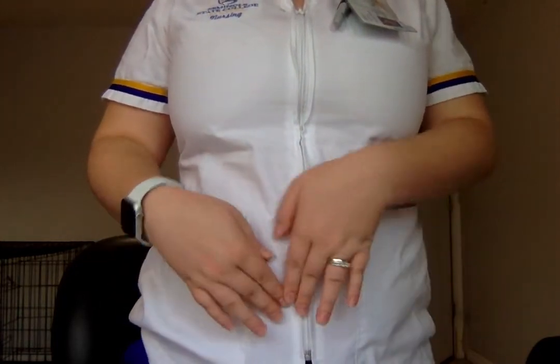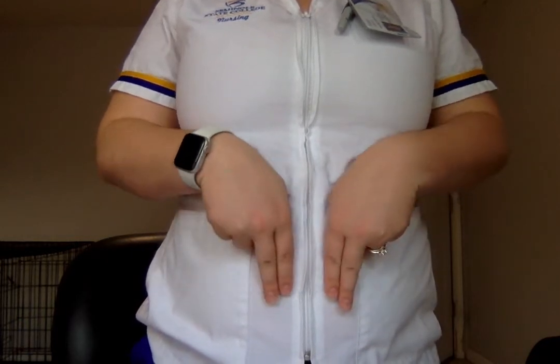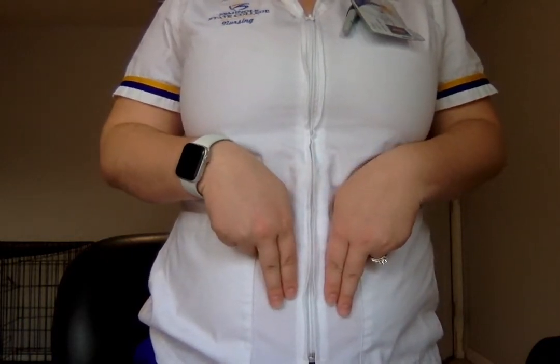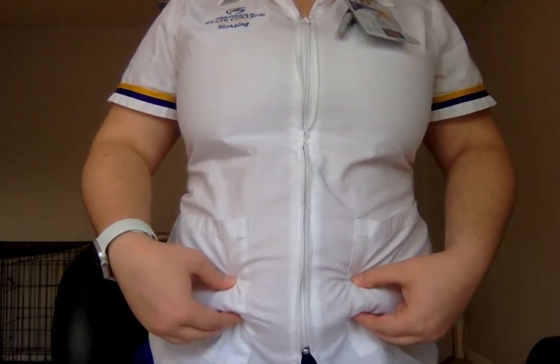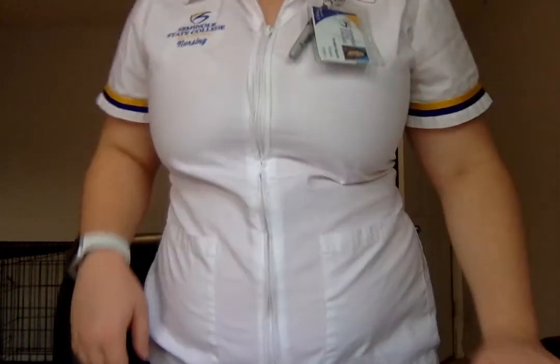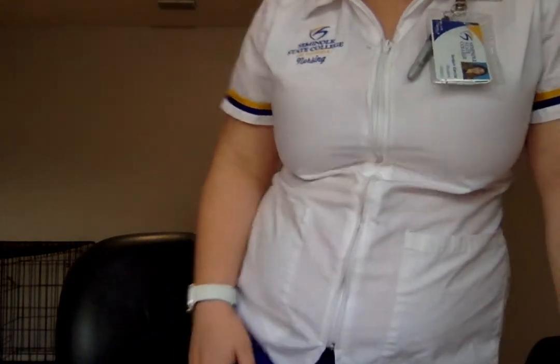They want you to avoid the outer 2 inches of the umbilicus area. So you do your 2 fingers here, and you go outside of that. Usually right here is where you'll do it on the abdomen. And then the third spot is on the anterior aspect of the thigh, so this front part of the thigh.